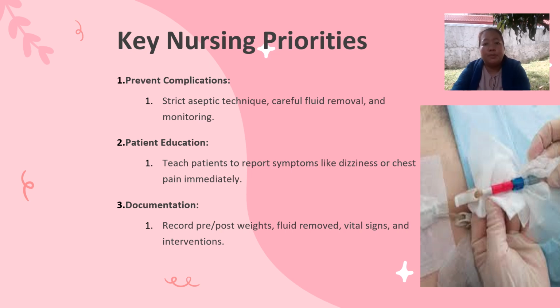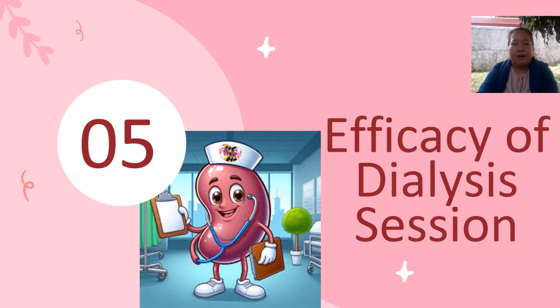Always have documentation. Record pre and post weights, fluid removed, vital signs, and interventions. Whatever you do with the patient, document it. What is not recorded means not done. Always remember that, nurses.